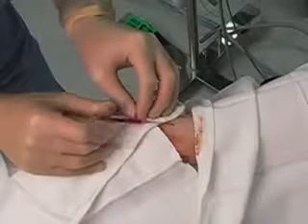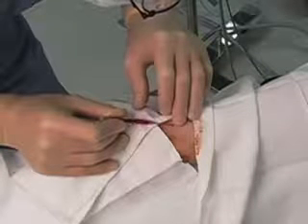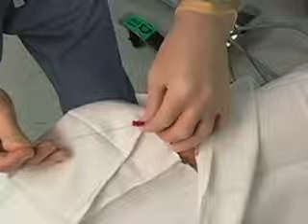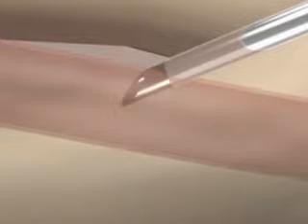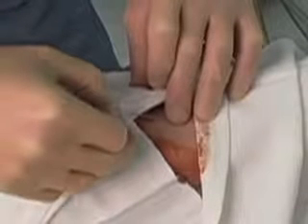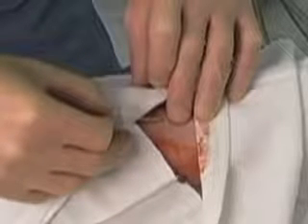There are some common problems that can occur during arterial line placement. If in the over-the-needle technique no blood return is obtained after the initial flash, the catheter can be advanced through the vessel and the over-the-wire technique can be employed. Occasionally, free flow of blood is observed but the catheter will not pass easily. In the animation, you can see how the tip of the needle might be within the vessel while the catheter remains outside. By advancing the needle slightly farther after the initial flash of blood, the catheter can enter the artery, allowing for successful cannulation. In some instances, the catheter may get hung up on the skin, making it hard to advance. The risk of this can be minimized at the start of the procedure by making a skin nick using either an 11 blade scalpel or a larger bore needle.